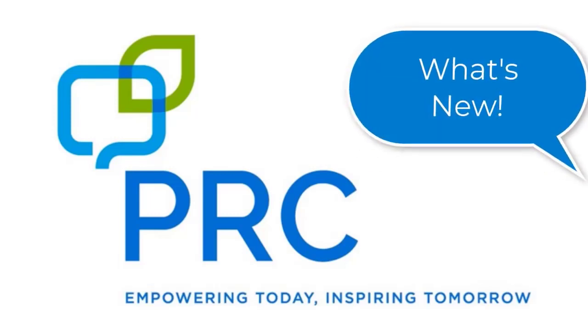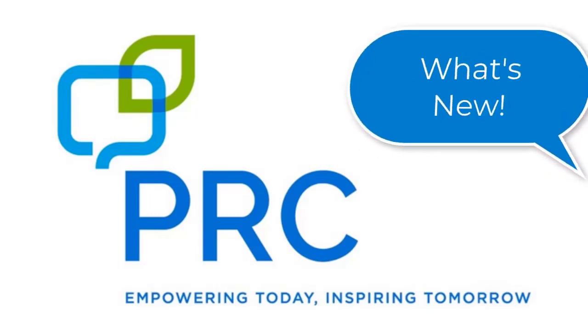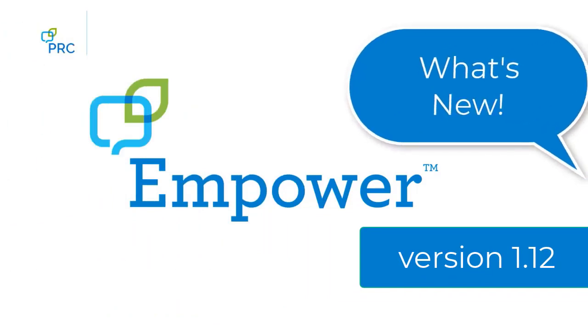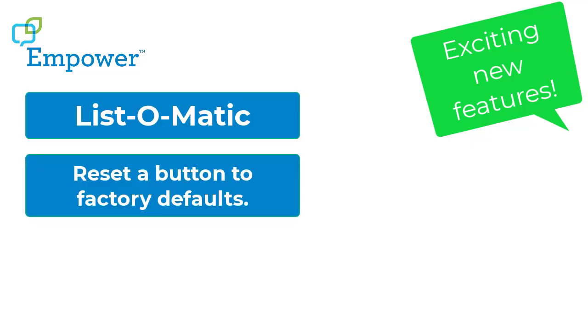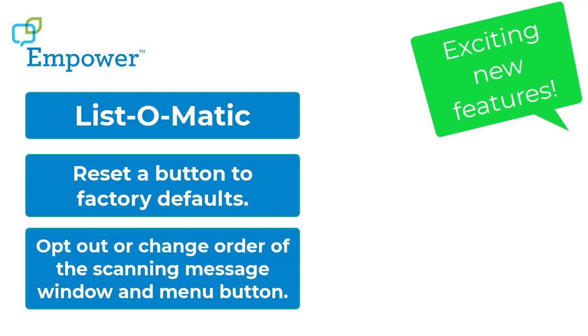What's new at PRC? Empower version 1.12 updates. Exciting new features to talk about. List-o-matic. Reset a button to factory defaults. Opt out or change the order of the scanning message window and menu button.